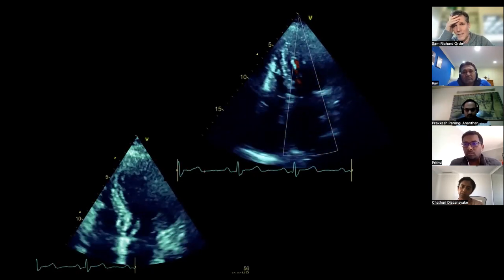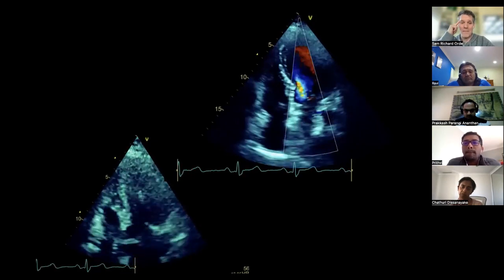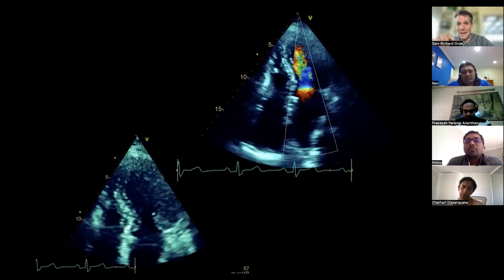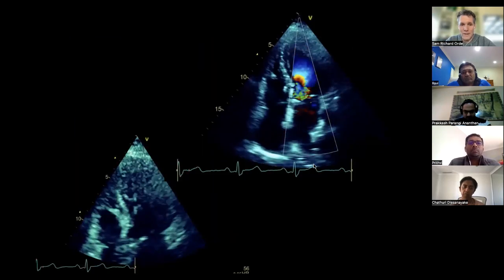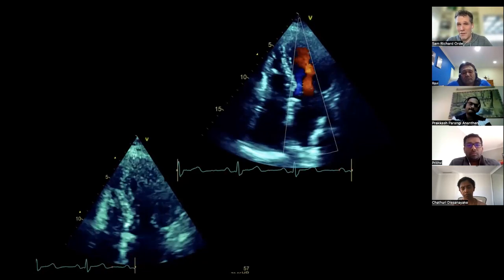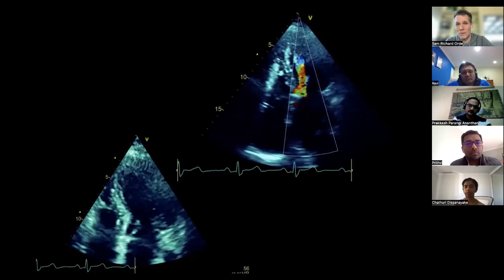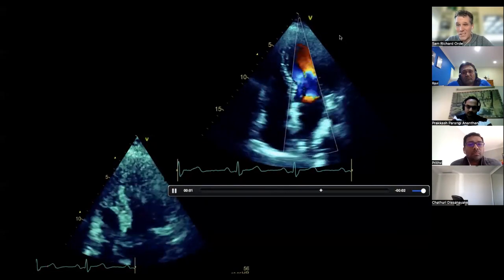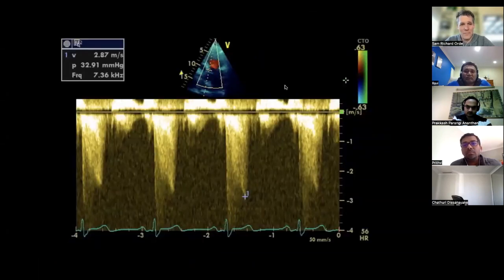So that if you've got some findings in your first one, it's going to be of importance in the next slide potentially, okay? One of the things we can look at here is that you picked up the turbulence really nicely, and I could have probably prompted you a bit more, but we've got a kissing ventricle sign, right? That ventricle doesn't look well filled. You could potentially argue that I'm off axis a bit. You can see that apex swinging down towards the base. So I may have foreshortened, but I think we're starting to see some form of mid-ventricle turbulence in there as well. And that's what takes us onto this image.